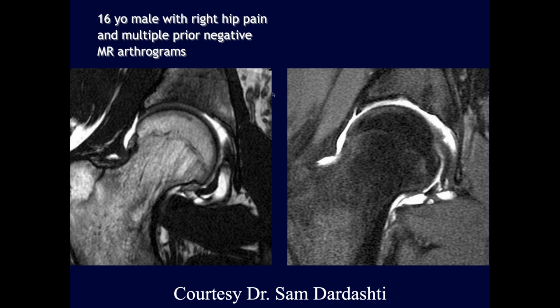So John, the only labrum we see up here is a superior labrum, and that looks pretty good to me. I think the problem is down here inferiorly. Is that part of the labrum? That's just right below it. Yeah, there's no labrum inferiorly here. The labrum is superior, goes anterior and posterior, but inferiorly the labrum stops, and instead you have the transverse ligament.